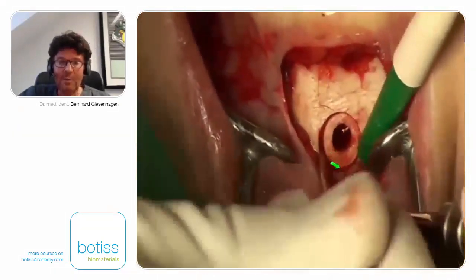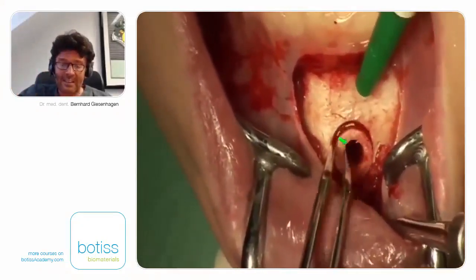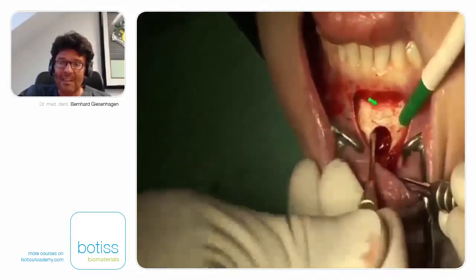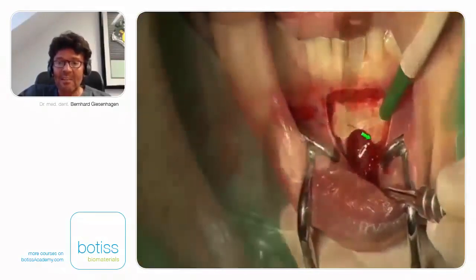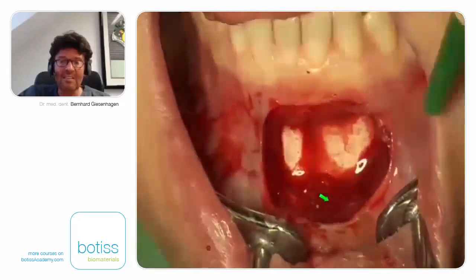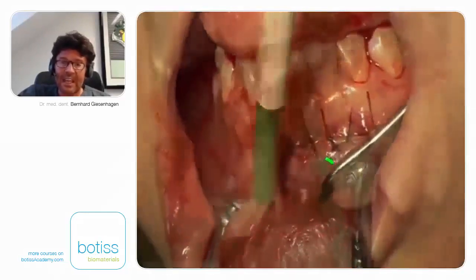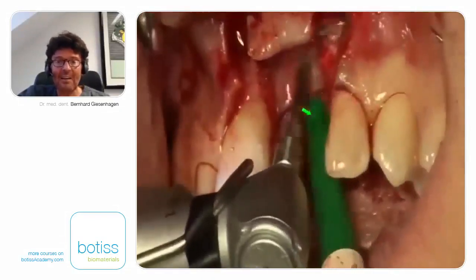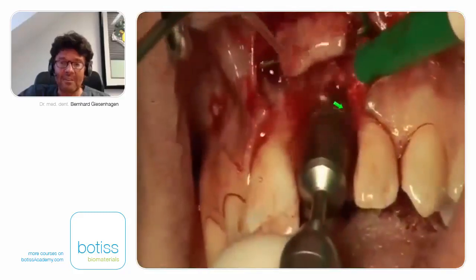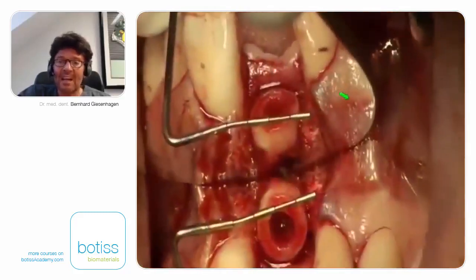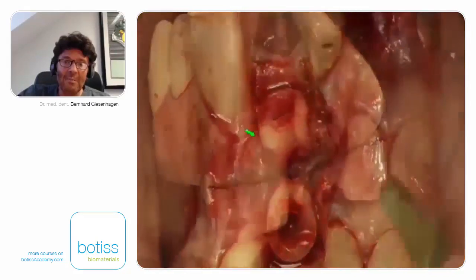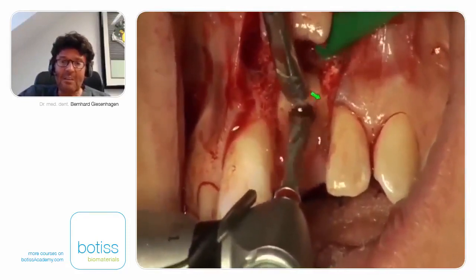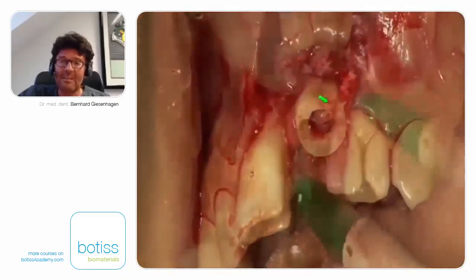With the ring remover rasp, we remove the ring from its bed, place it in a small cup, and store it in blood. Any additional bone chips can also be harvested. The donor site is filled with a collagenous sponge and sutured. Back at the recipient site, we fix the implant position with a guide — the right implant position in the aesthetic area is crucial. The ring bed is prepared with a trefine, the ring fits well in terms of vertical dimension relative to the bone level of adjacent teeth, and the ring is used as a template for final implant bed preparation through the ring into the local bone.